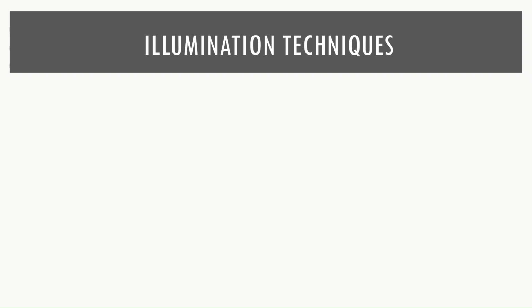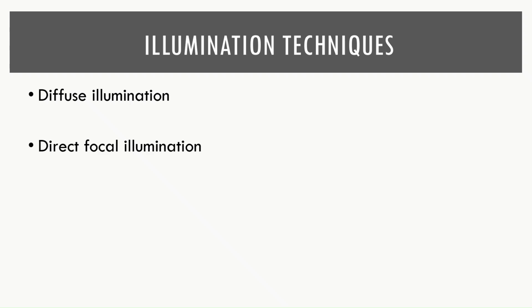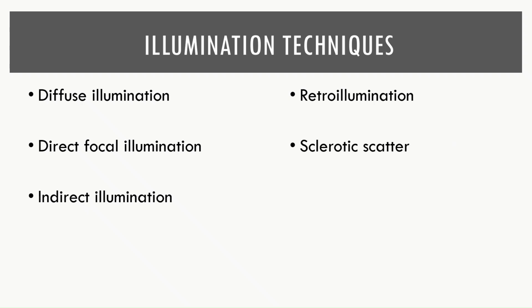Multiple illumination techniques are used in slit lamp examination, each highlighting different structures and pathologies. These are diffuse illumination, direct focal illumination, indirect illumination, retroillumination, sclerotic scatter, and specular reflection.